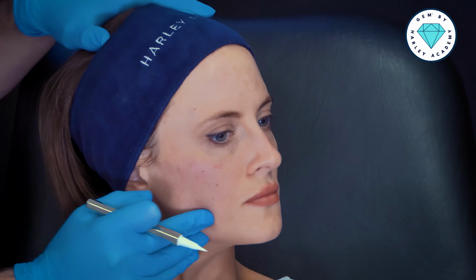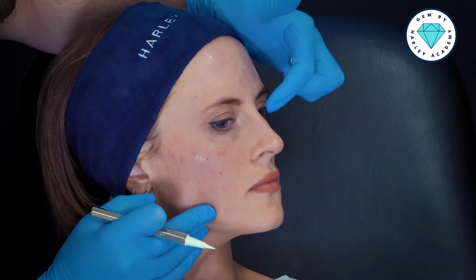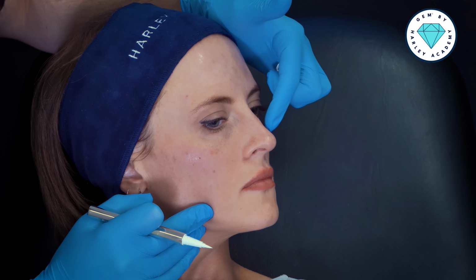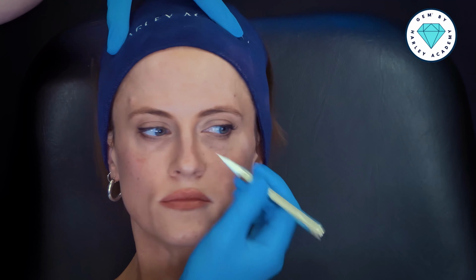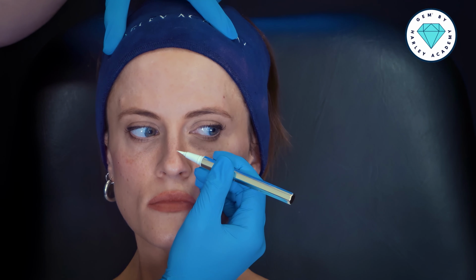We can see there is a dorsal hump, a very small dorsal hump, which we could straighten out by adding some product above and below. And in the process here, we can also apply a little bit of product to the lateral aspect of this nose here to address that little notch on the left side of the dorsum.